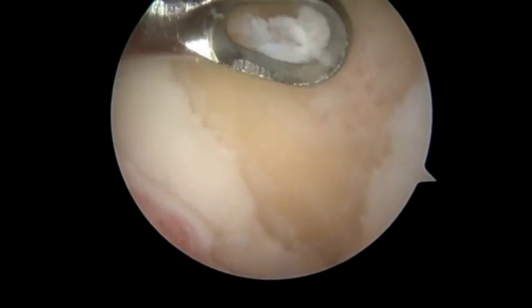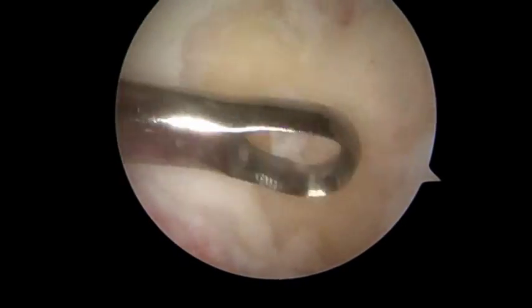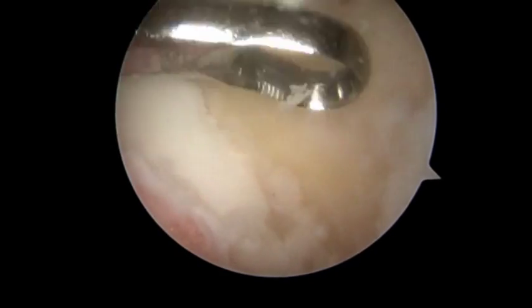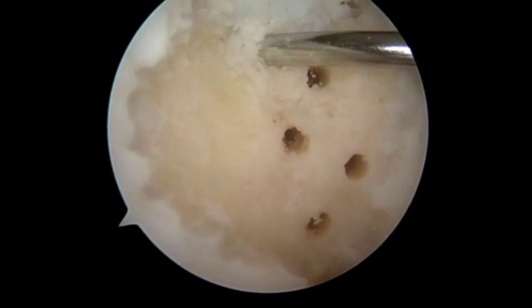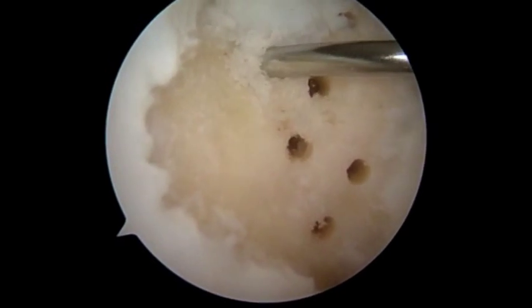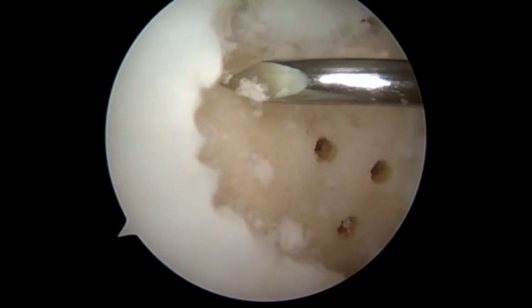You will also see in the video, it is helpful to switch portals to help with your curetting of the lesion. Similar to the first case, we used a small K-wire to perform the microfracture. Again, we like the flexibility of using either the K-wire or the Arthrex PowerPick.